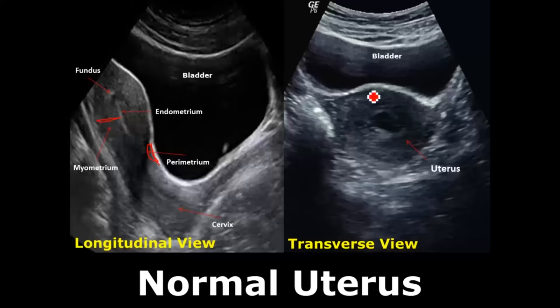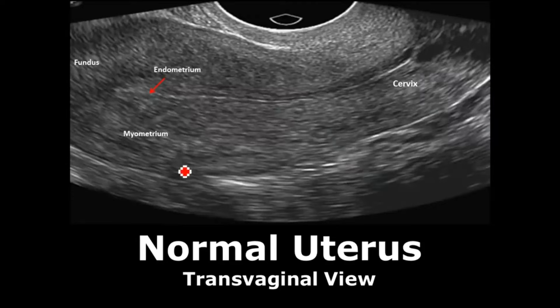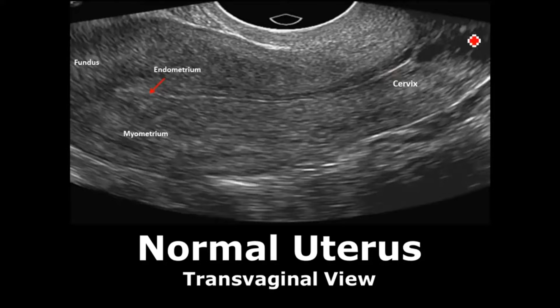In the transverse view, this is the appearance of the uterus below the bladder. In the transvaginal view, we see more detailed information of the uterus — a zoomed-in view giving us more detail. The endometrium is seen more clearly, with the fundus on the top and the cervix on the bottom. The myometrium is also seen very clearly.